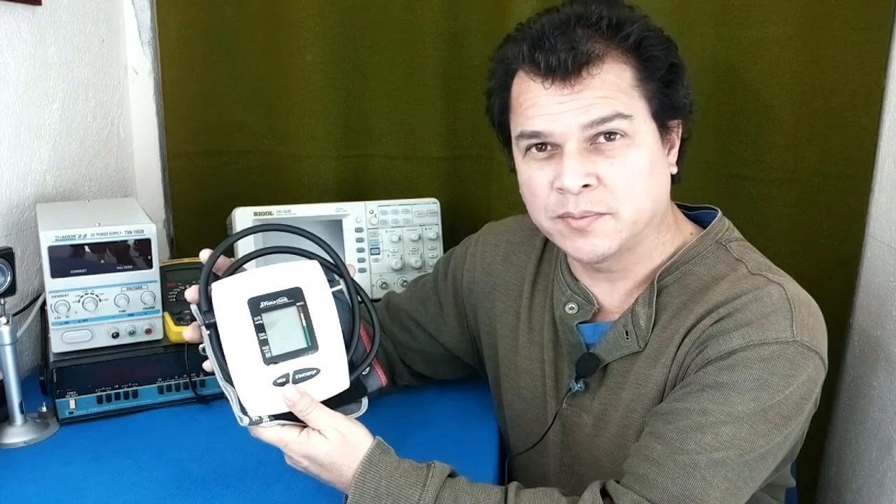Yesterday somebody came with a blood pressure monitor that has two problems. The secondary problem was cleaning the battery chamber. The main problem was there was no problem, so I want to talk about it. First let's see how I cleaned the battery chamber, and later let's see why I wanted to talk about it.